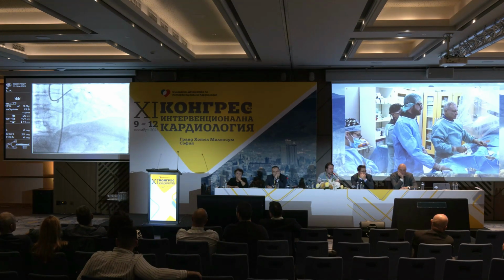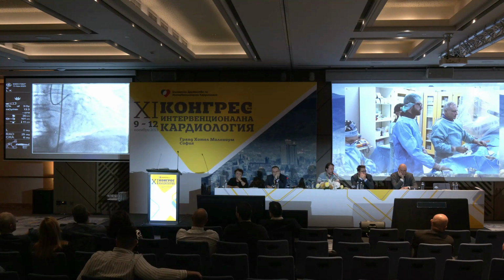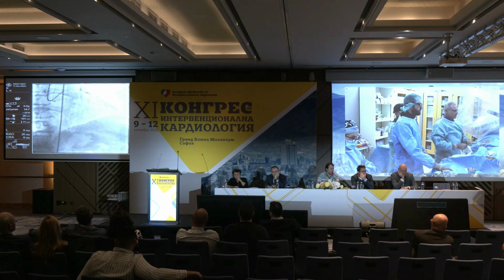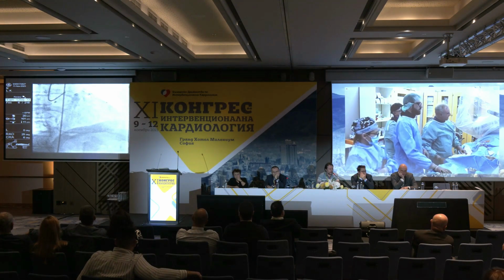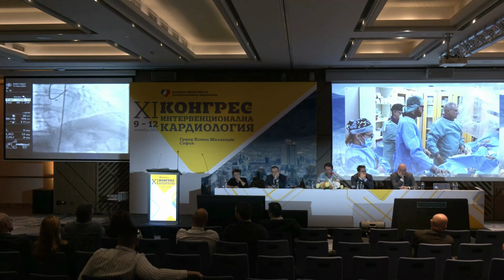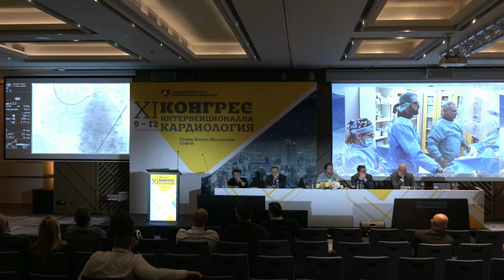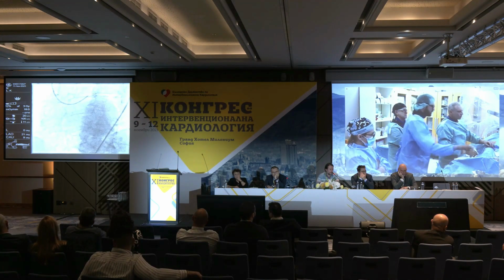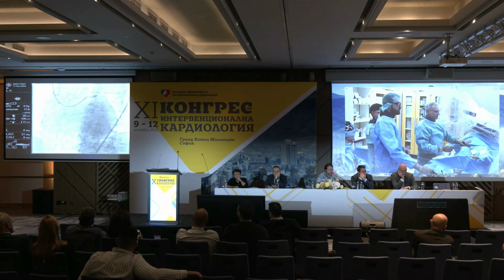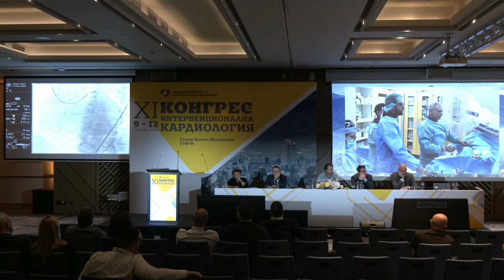It was septal surfing, and I had the feeling that this was a little bit of a short microcatheter, but I see that the catheter is tracking very nicely. Save that. That's another proof that when you have a good selection of the technique and when you have the anatomy, you don't need really to struggle too much. Just go and follow the procedure. Of course, retrograde techniques, we know that they're related to higher complications compared to the other techniques, but experience is a buffering parameter also.